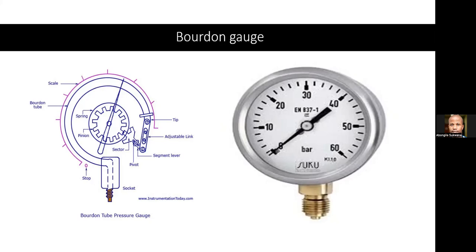And then who can tell me, the question is: is the Bourdon gauge connected to a nitrous oxide cylinder reliable? If yes, why? If no, why? Can you explain the physical principle behind that?